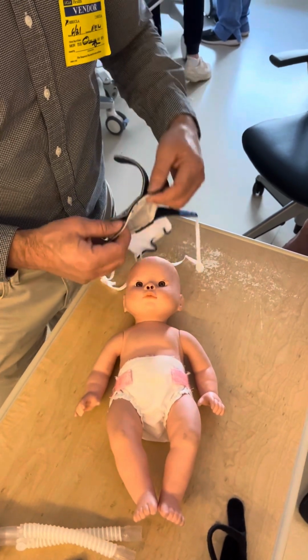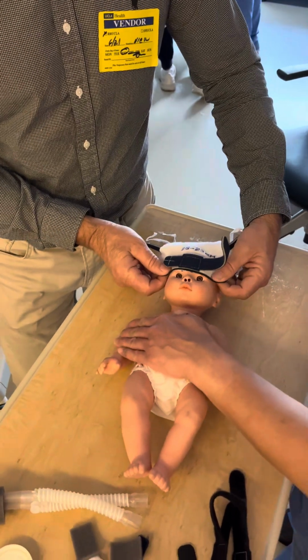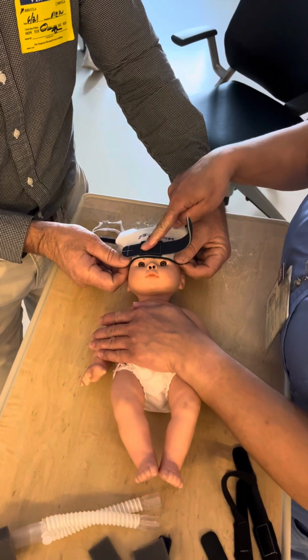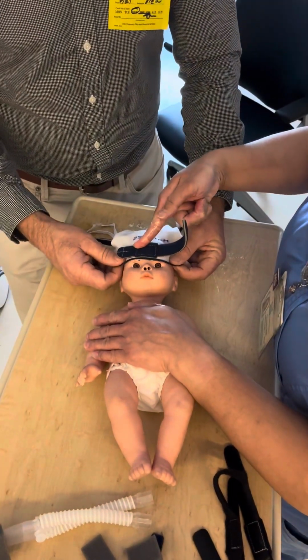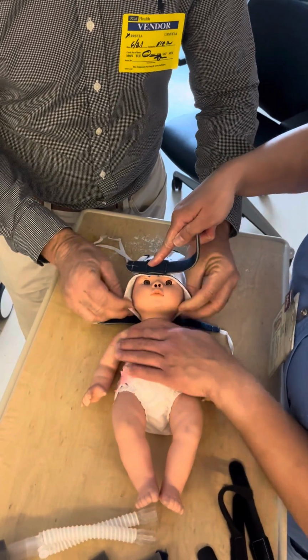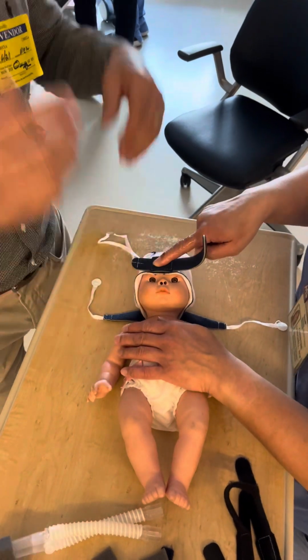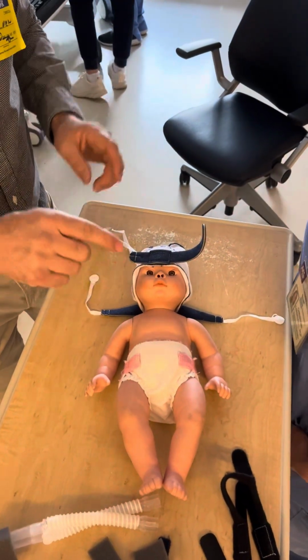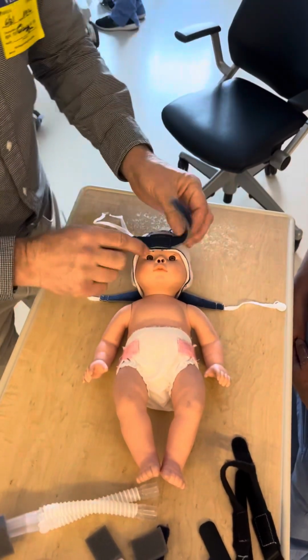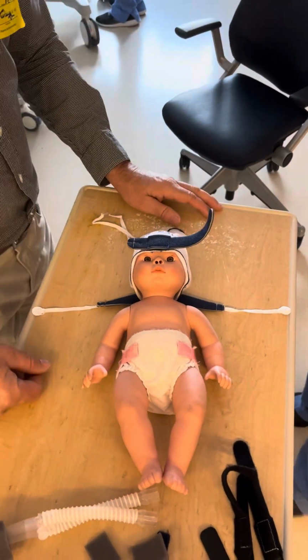The easiest way to do this, so Christine, put your hand on the baby. Once I put the rectangle in between the eyes, take your index finger from your right hand and place it right on the bonnet. That's it. That's all you can do. So you created an anchor point so that I can work off of that, and I have all the hands I need to scoop it underneath. Now I made that look a lot easier. My baby is not alive, obviously, but that's still going to be easier than coming from the back to the front. Okay, so we got this in between the eyes. We take these straps, we stretch it out, and away we go.